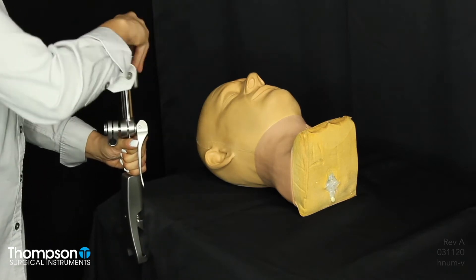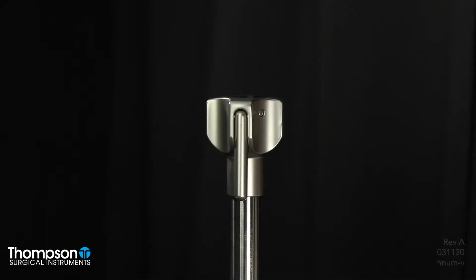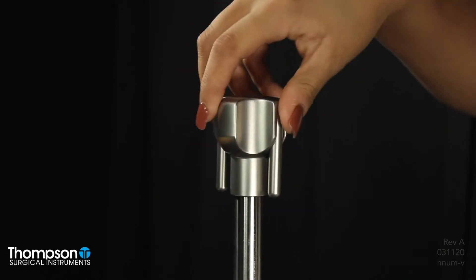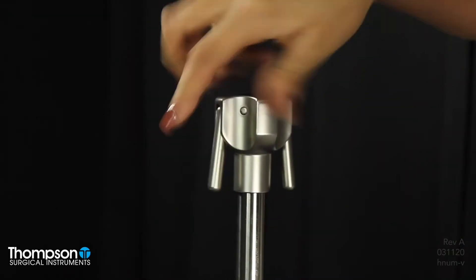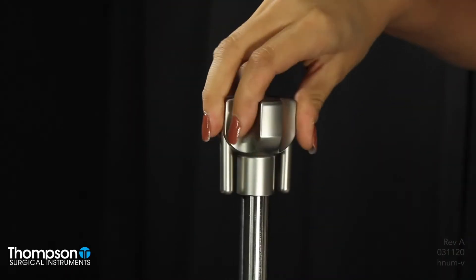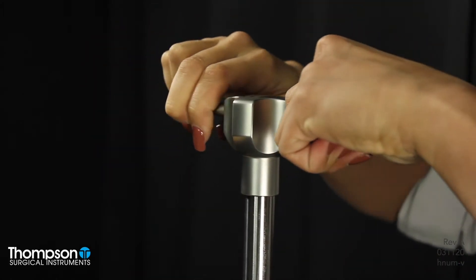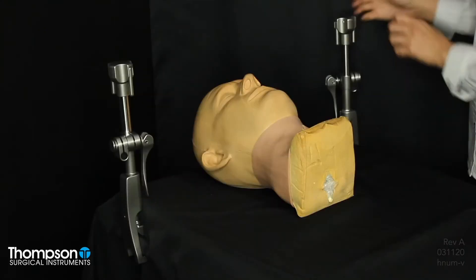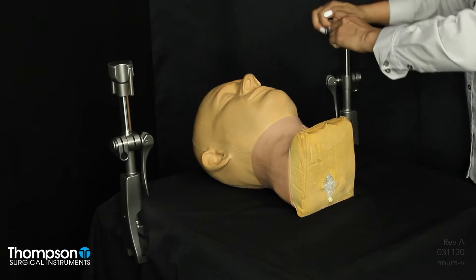We will first begin by attaching the Elite rail clamp to the OR bed rail. Open the rail clamp's jaw by turning the top knob counterclockwise and turn the knob clockwise to tighten. Utilize the hanging handles for additional leverage as needed. Repeat with the second Elite rail clamp on the opposite side of the table.